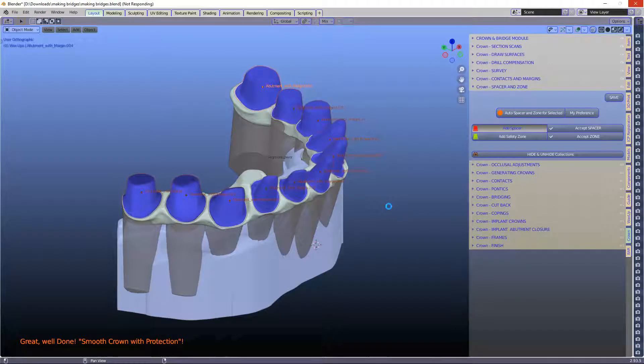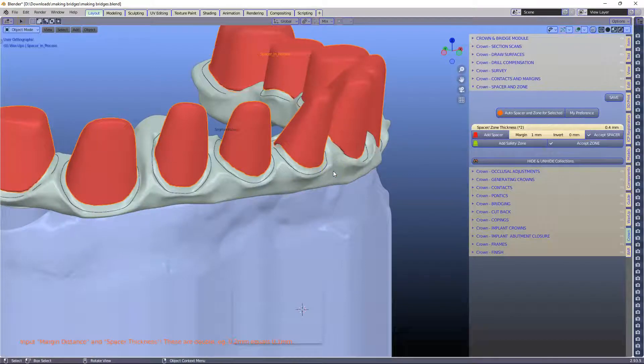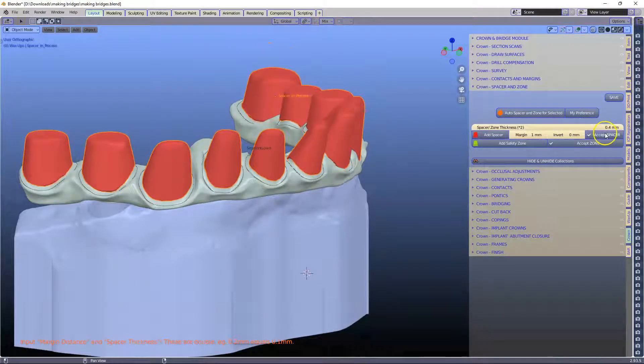I also want to show you something else that I've put in. Let's go at 0.35 — actually, let's make it excessively thick: let's make it 0.4 millimeters thick just to see if this works.